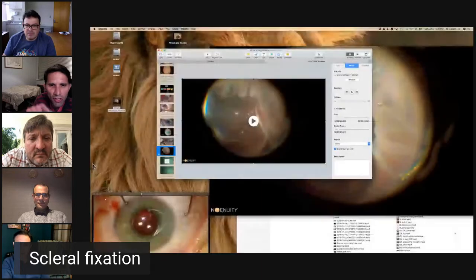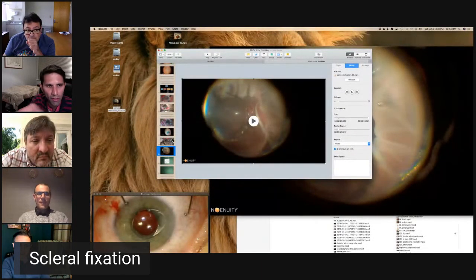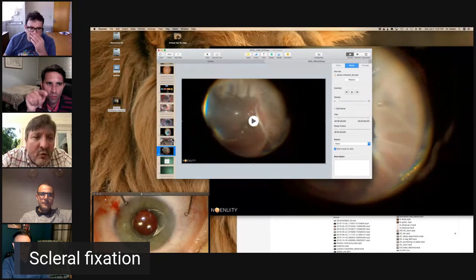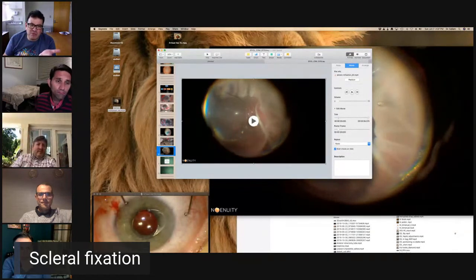But Ahmed, do you then leave that inferior sclerotomy that you've threaded the Gore-Tex through unsutured? Yeah, if you dunk, you leave it unsutured, unless there's hypotony, then you suture. Or you can do a partial air fluid exchange, and that mitigates the hypotony. But then the problem is I try to avoid air with these lenses because they can opacify.